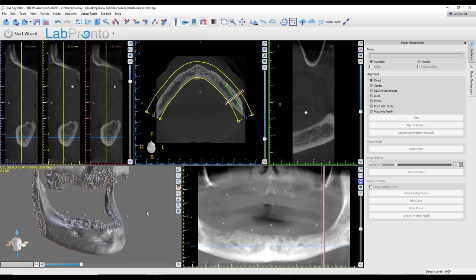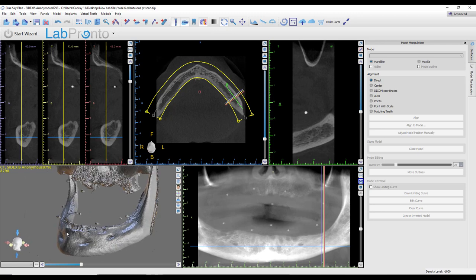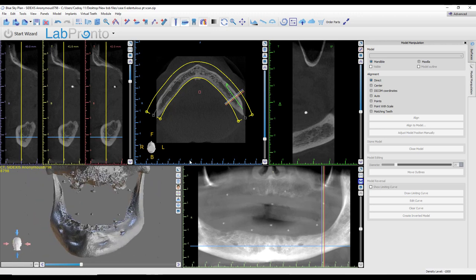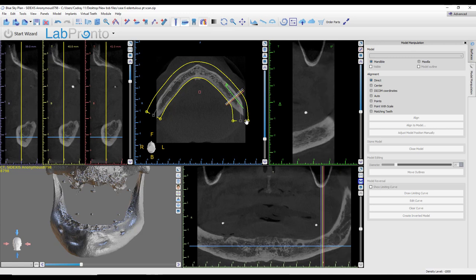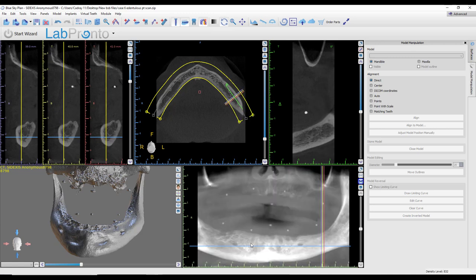This is an edentulous case, and so far I've not done anything except open up the DICOMs of this case. The first thing I'll always do in every case is set my panoramic curve. I want this curve to be following the jaw I'm working on. You can grab those nodes and move them so they're centered over the jaw to see it clearly in the panoramic window. If I'm doing mandibular implants, the next thing I would do is map that nerve.